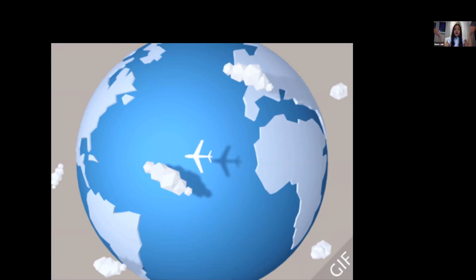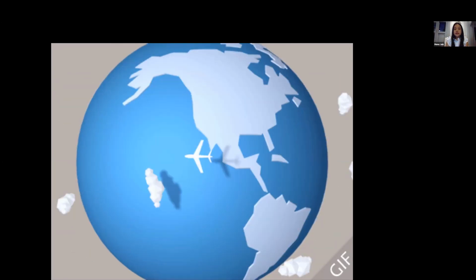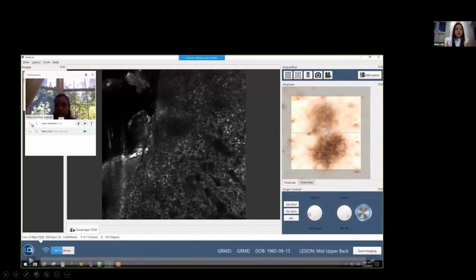So we are all in the digital era. We are doing all the tele things. And this was one session we actually recorded. This was with a clinic in LA, and I'm sitting in Tarrytown in my home on a weekend. The patient is scheduled, and this is the screen of that microscope. They are sharing the images with me right now, and this is what the lesion looks like.